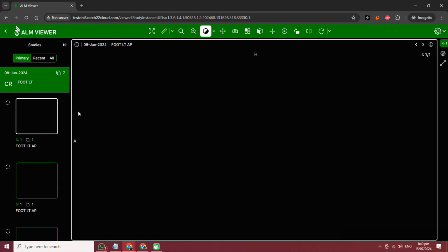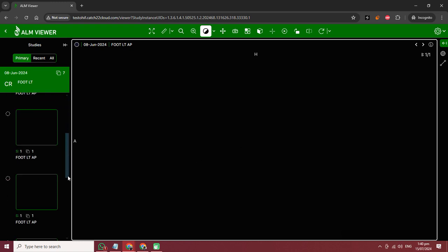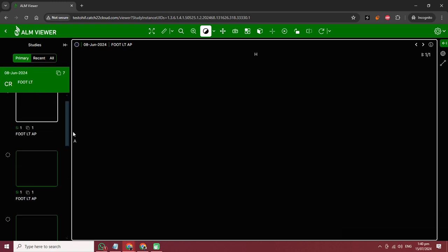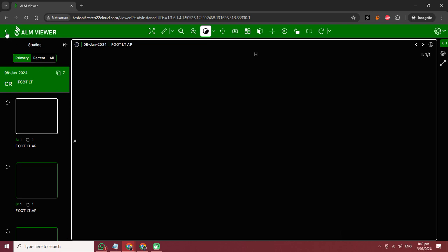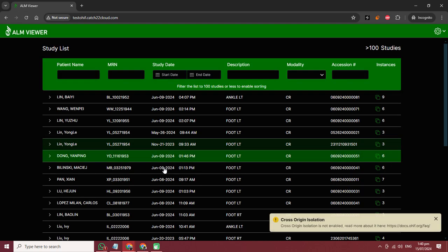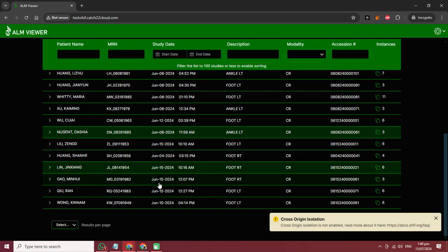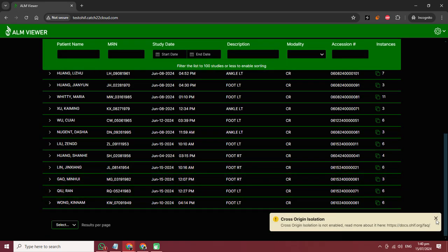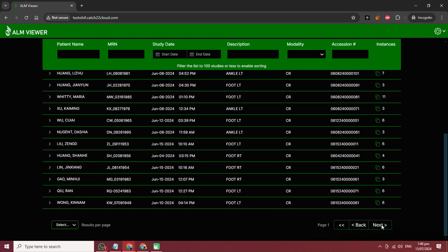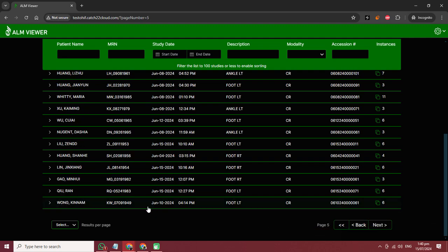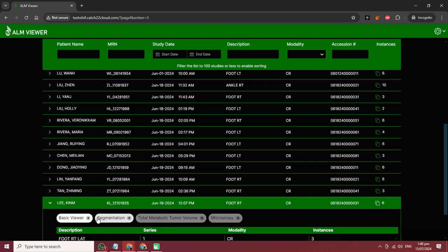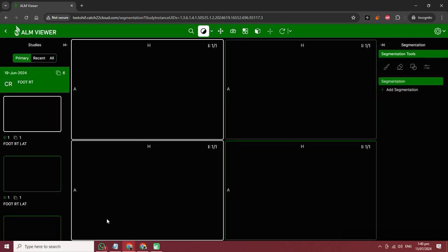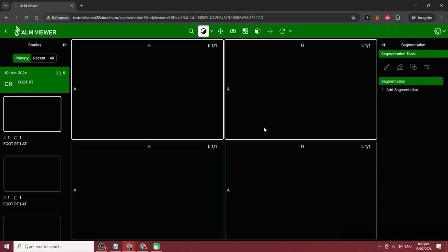My internet is slow, that's why it is taking time to load. See this - multiple studies. Next, next, next... okay, we will try any other segmentation. See this.